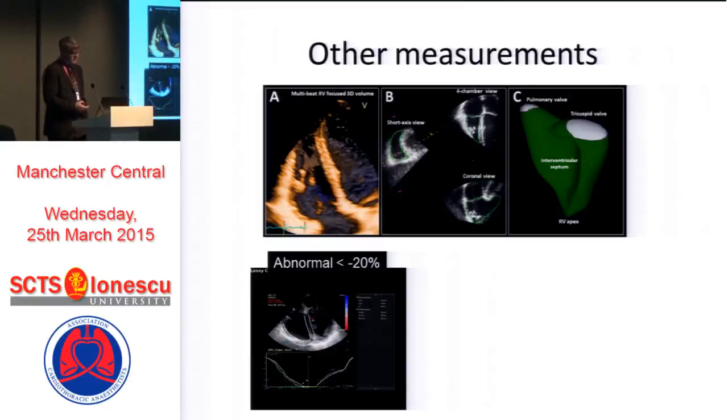There are also new measurements which are available for transthoracic echo, 3D measurements of the right ventricle. So far, at least in Canada, I don't know about the States, the software is not yet available for TEE. You have to do it offline.